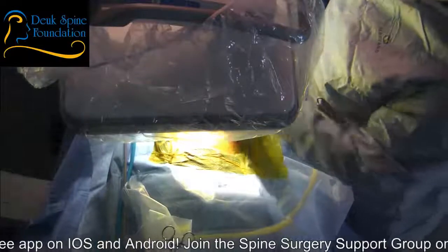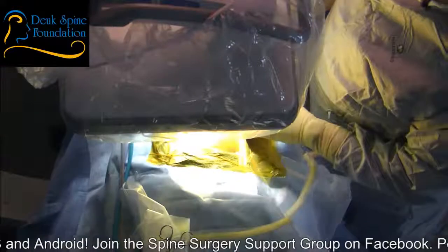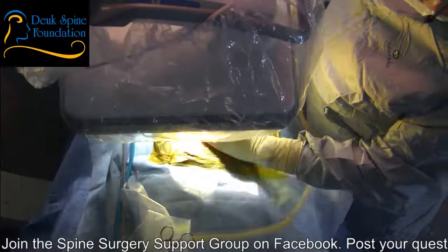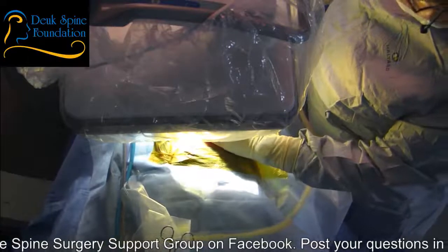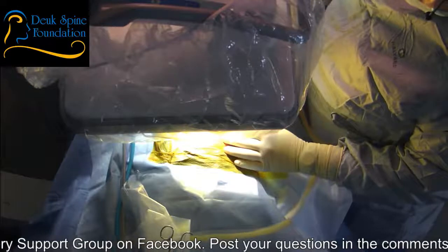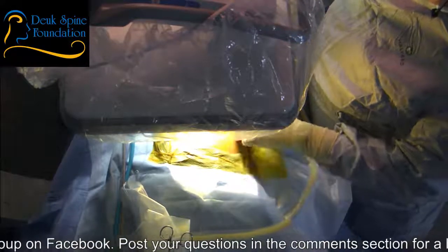Yeah, that's my hand on your back there. I'm just feeling around. All right, you comfortable? I'm going to give you a little medicine to get things going. You'll feel a little stick and burn. It'll just be for a few seconds. It'll get better, okay? You're doing great. Everything's okay. That's just the numbing medicine going in.